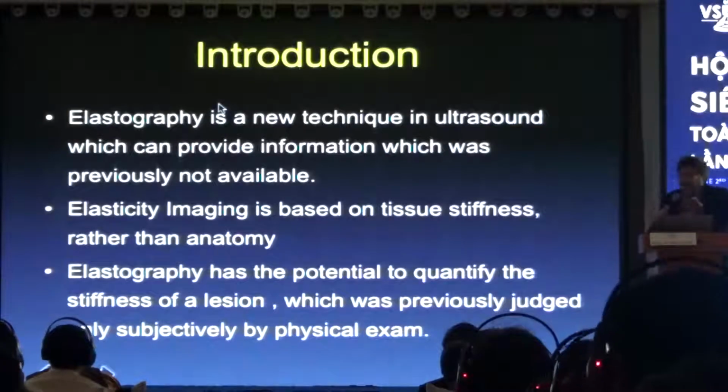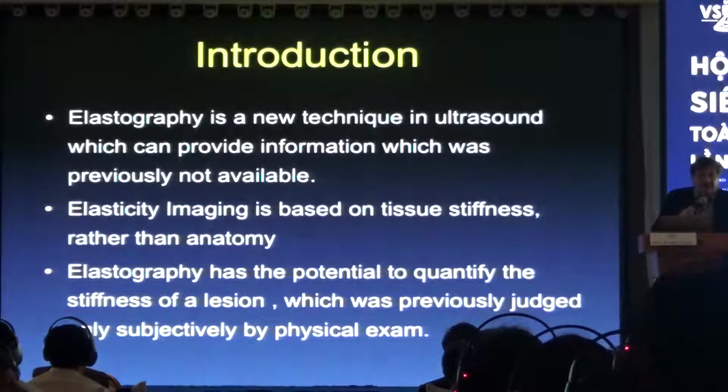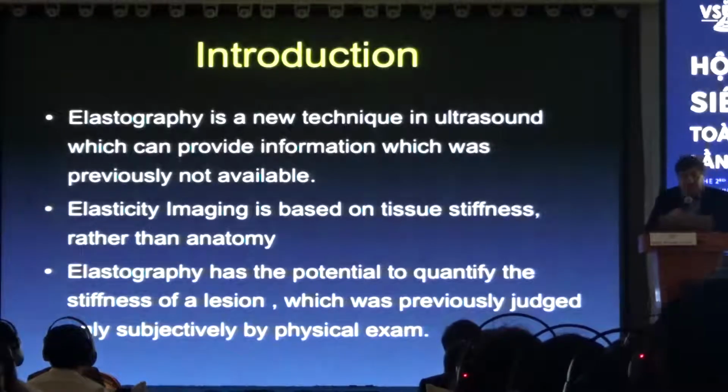So elastography, first of all, for this breast, I have many slides and I'll never be able to go through all of them, but I included them so you have them in your syllabus. So I may go through some slides very fast, but all the information is in your book.